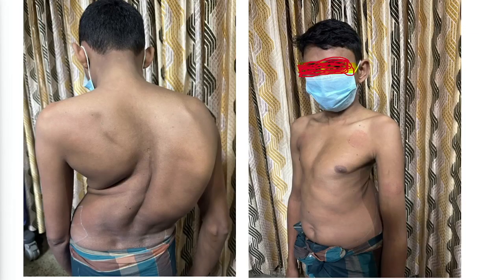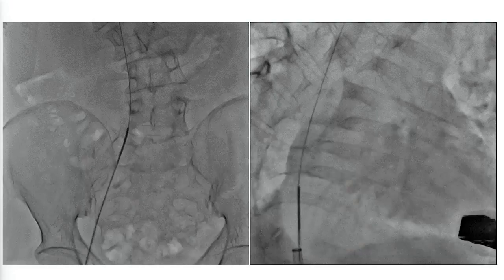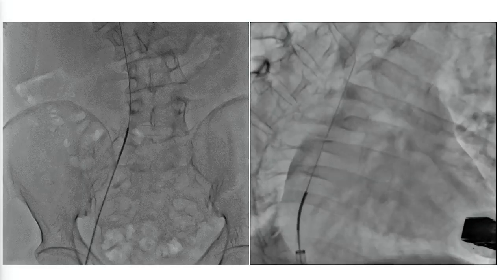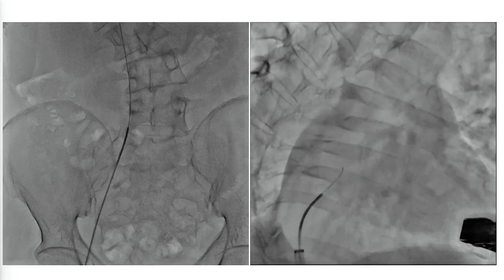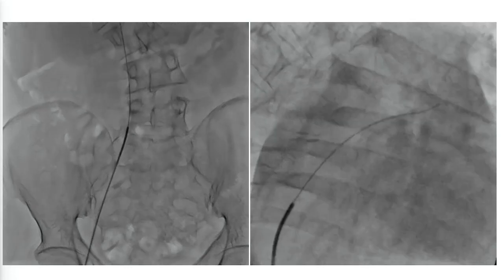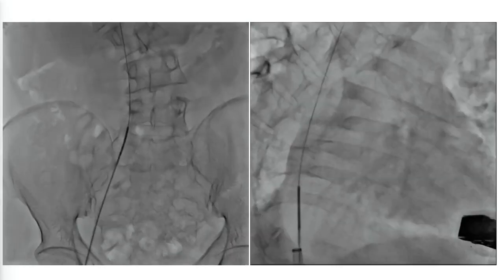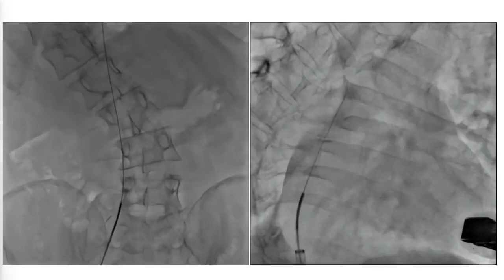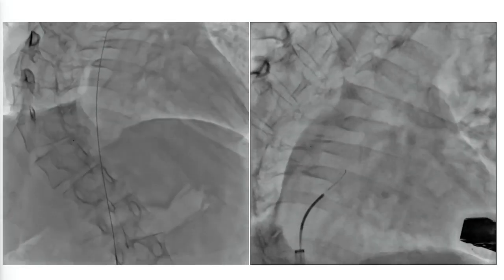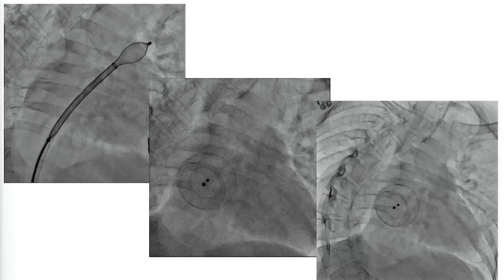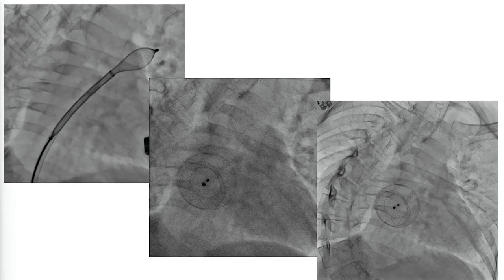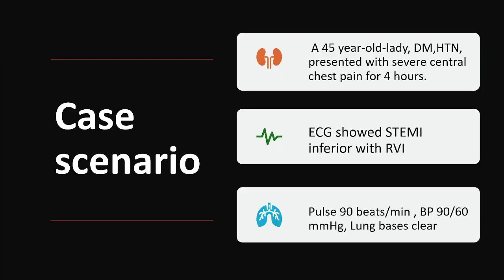This is another case — a surgeon's nightmare — an extremely kyphoscoliotic patient, and we deployed the device without any difficulties. You need to know the anatomy properly; this is how we deployed the device.